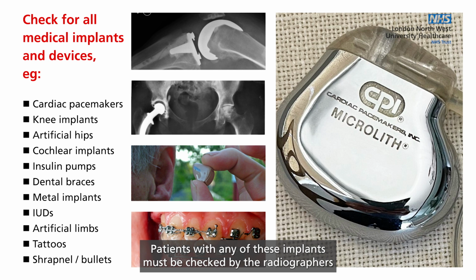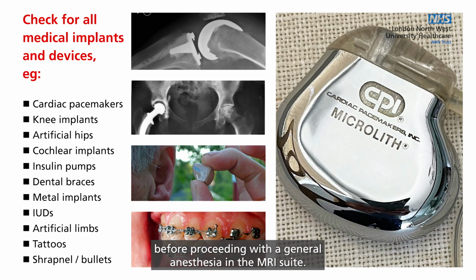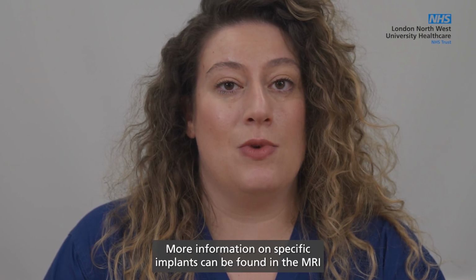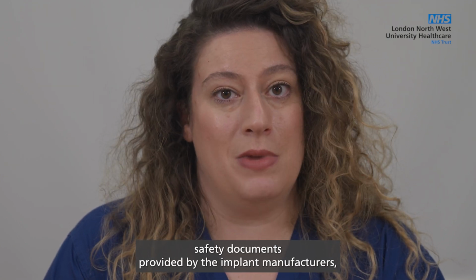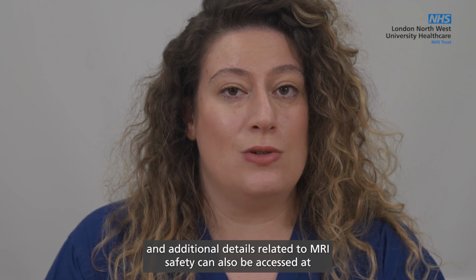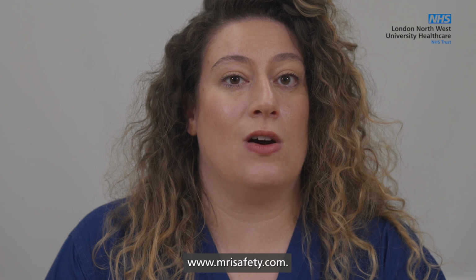Patients with any of these implants must be checked by the radiographers before proceeding with the general anesthesia in the MRI suite. More information on specific implants can be found in the MRI safety documents provided by the implant manufacturers, and additional details related to MRI safety can also be accessed at mrisafety.com.